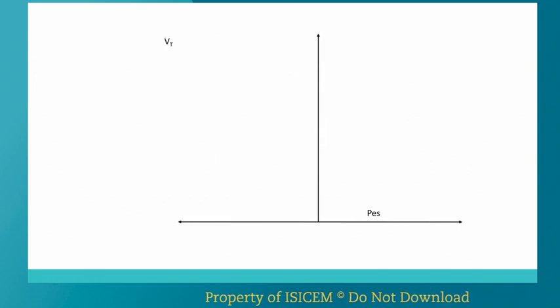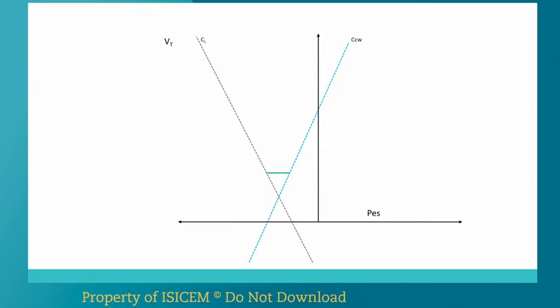And you can use this in patients who have various pathology, as this is a schematic example. But here, for instance, you have a situation where you change the pressure, but you don't gain any volume, and this is above FRC, so this could be indicative of intrinsic PEEP. So that's the pressure that the patient needs to generate to overcome intrinsic PEEP.